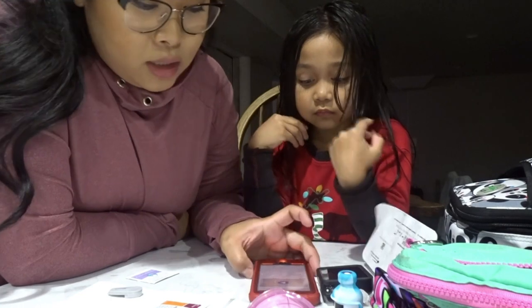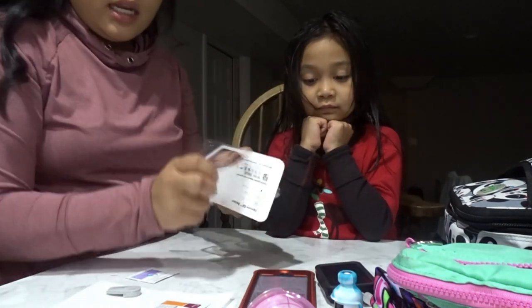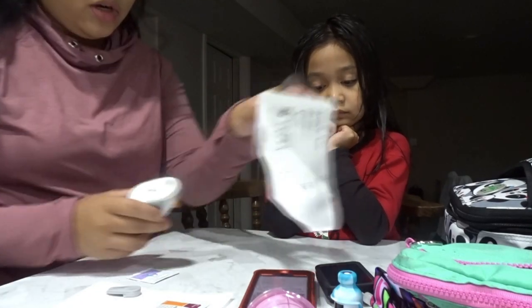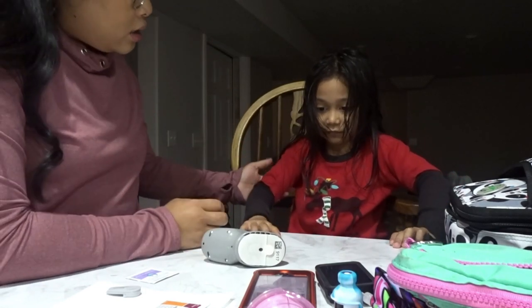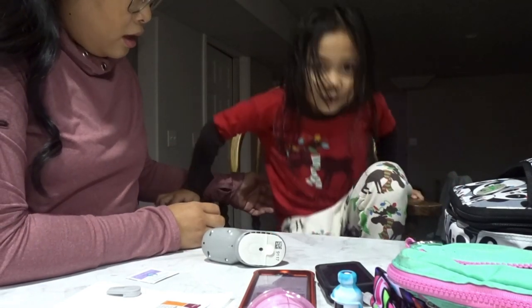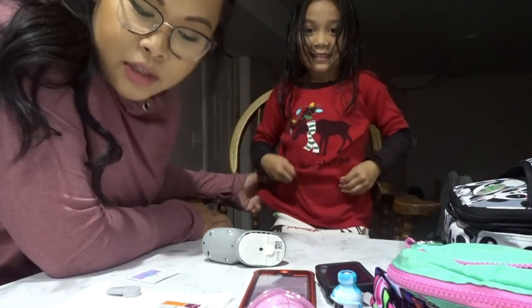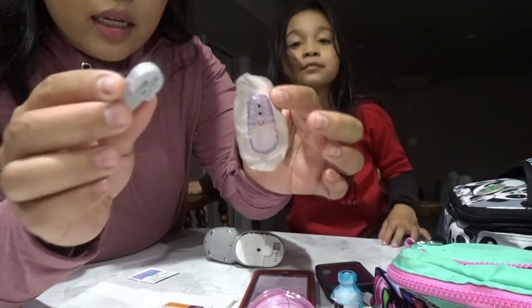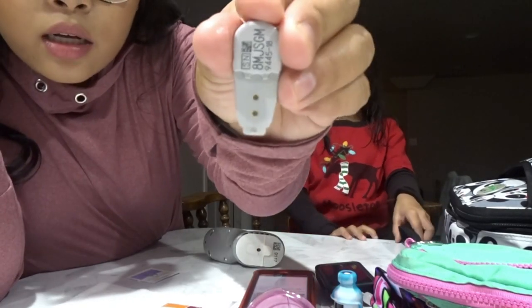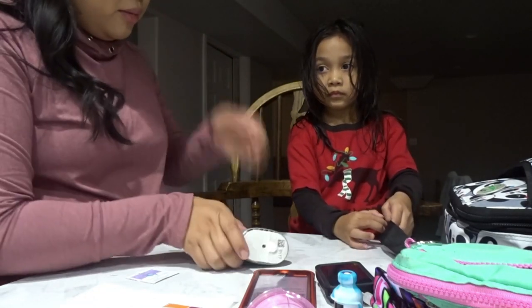Now we get to put on the sensor. We're going to take it out of the container. She just got out of the shower so her skin is all clean and prepped. She's wearing her Christmas outfit and is ready! I took off the old transmitter and cleaned it with alcohol - just make sure those two prongs are clean.